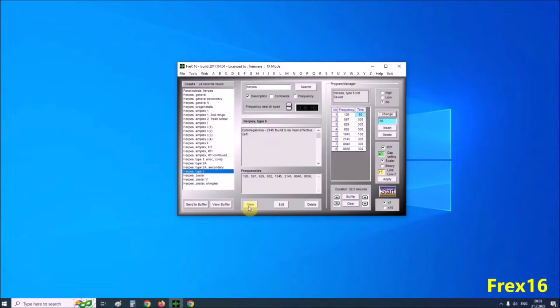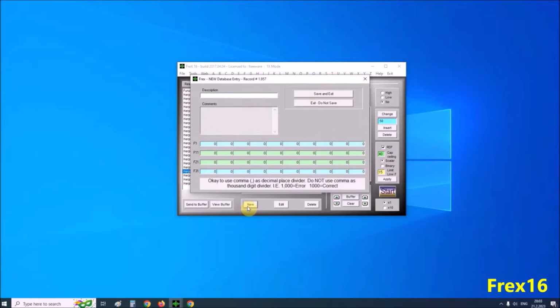We do it as follows. We press the edit button and enter the frequencies we know from another source in the fields in order. For example, etc. We can form a sequence of up to 40 frequencies, as we see. Next we need to enter the name of the new program. For example, test. And click save and exit.